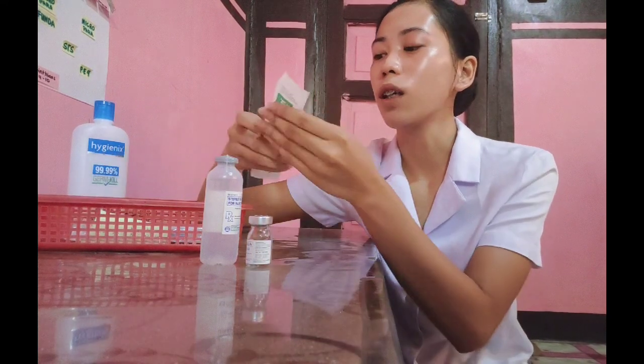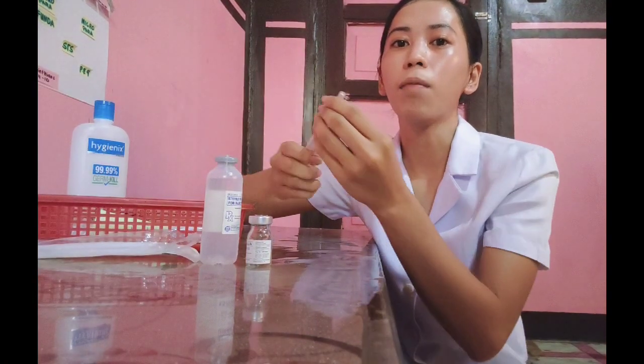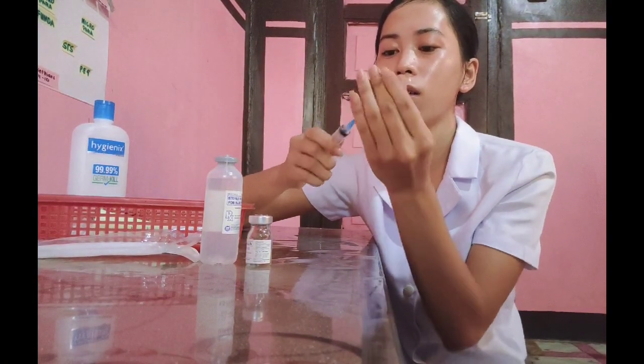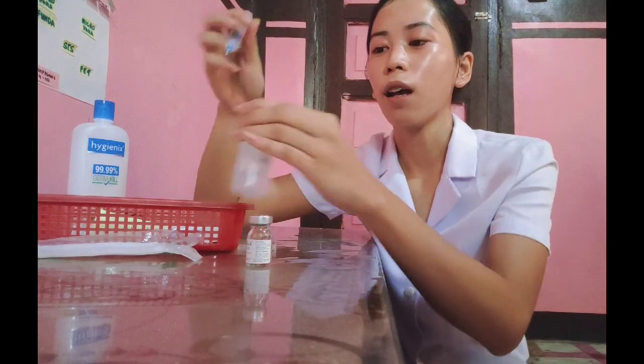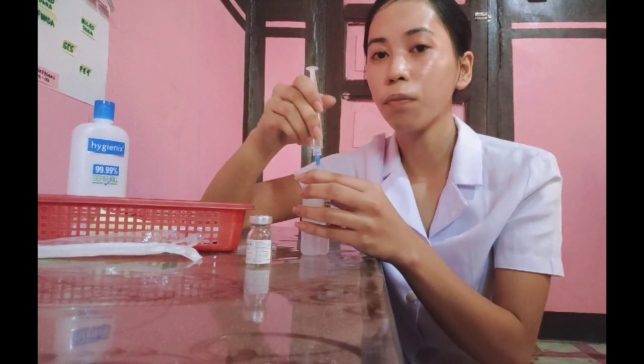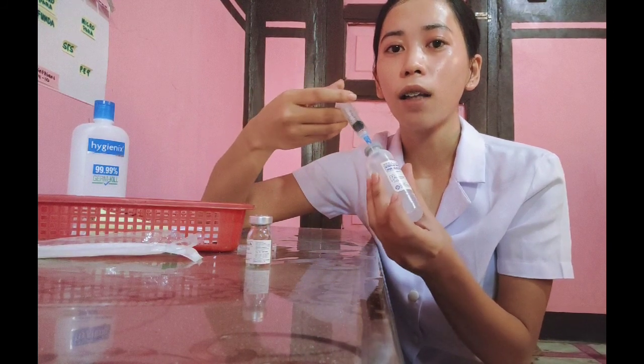The rationale is the antiseptic cleans the cap and reduces the number of microorganisms. And then withdraw an equivalent air from the vial before adding the diluent, unless otherwise indicated by the direction.